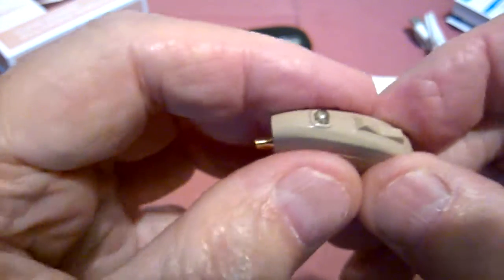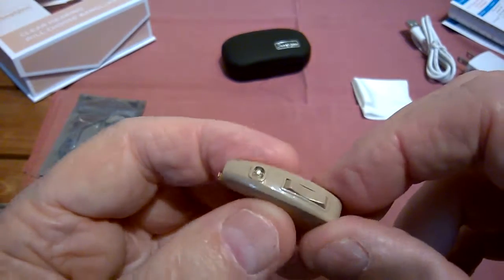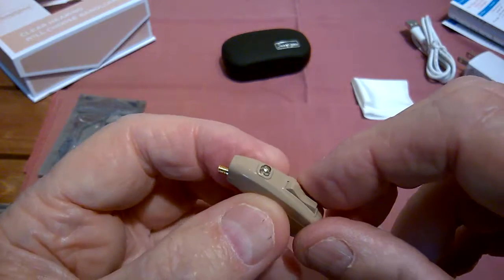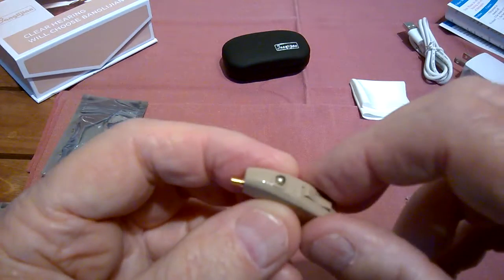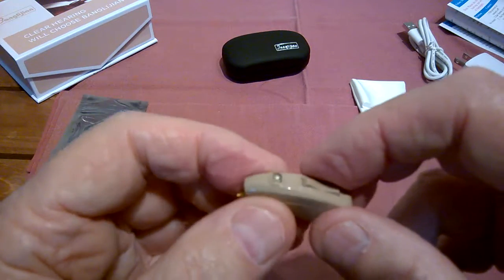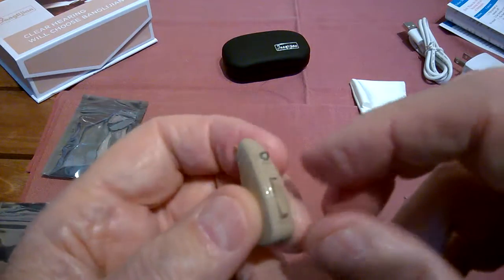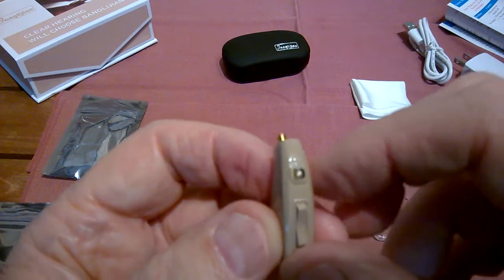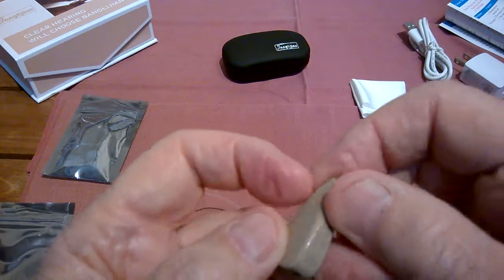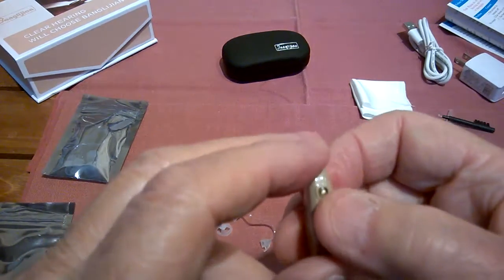Now, they're off anyway after you charge them. When you put the charger in there, it turns them off. It'll be blue while it's charging. When it's fully charged, it'll go from blue to green. And these charge in 2 hours, so you don't want to leave them overnight or something. Somebody else has one that does that. But these charge around 2 hours, and they're good for 20 to 24 hours on the charge. And that's basically it. Charging port on the bottom, volume control.